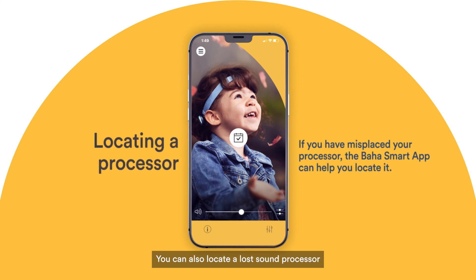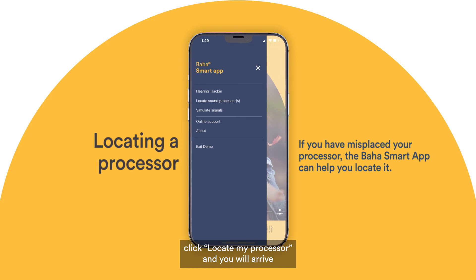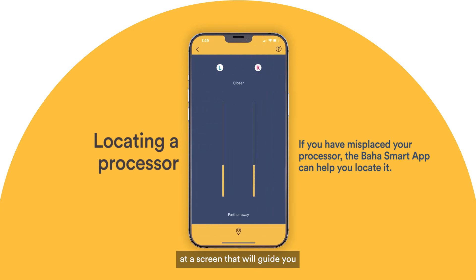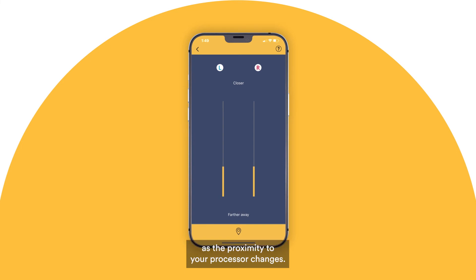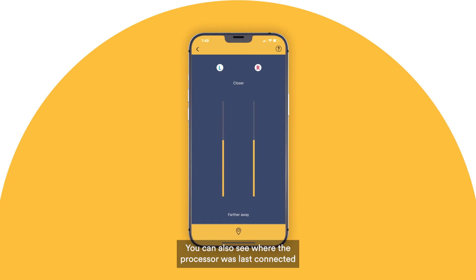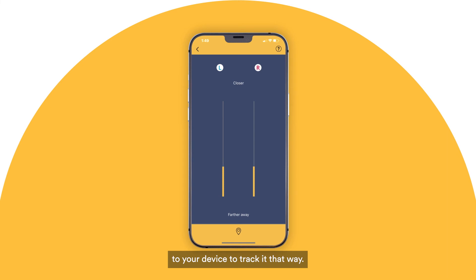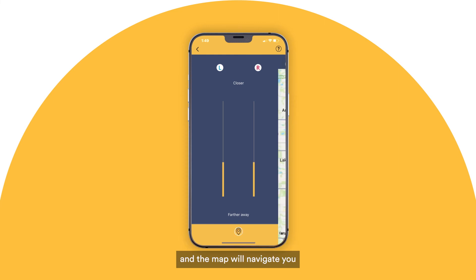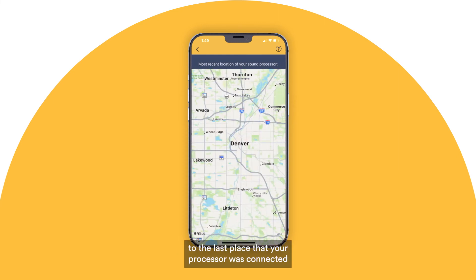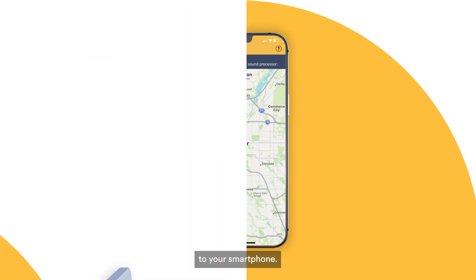You can also locate a lost sound processor from the Baha Smart app. To do so, click Locate My Processor, and you will arrive at a screen that will guide you to the last place your sound processor was connected to a compatible smartphone. The bar levels will adjust as the proximity to your processor changes. If your processor is too far away to find, you can also click on the pin icon at the bottom of the screen, and the map will navigate you to the last place your processor was connected to your smartphone.